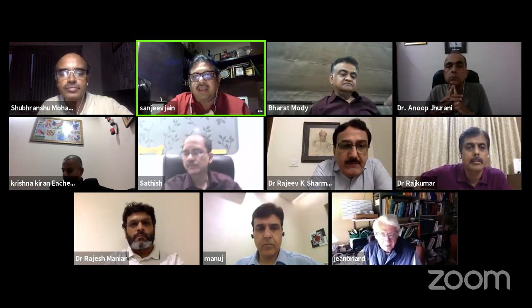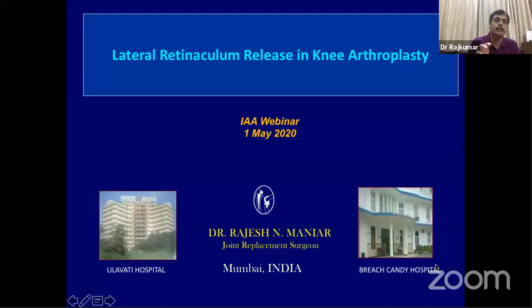If you see, even the smallest one is quite big in most patients. So would you like to give some tips there? Yeah, even the smallest one is quite big. If you are using a femoral component for a female, you have to ask specifically for the extra small. Normally they don't have it on the table routinely, so you have to ask for it.